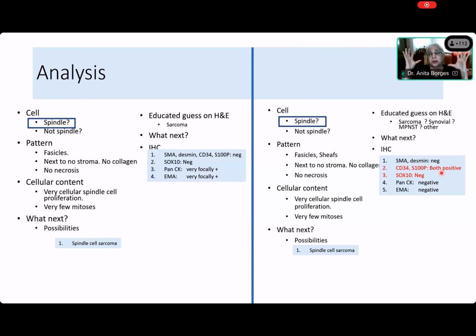We think that these are spindle cell sarcomas, but yet we did cytokeratin and EMA. Come on, Elsa. You know the answer. We have to answer the question of which sarcomas that are spindly and cellular might express cytokeratin and EMA. And this one's certainly, yes? There you are, synovial sarcoma.